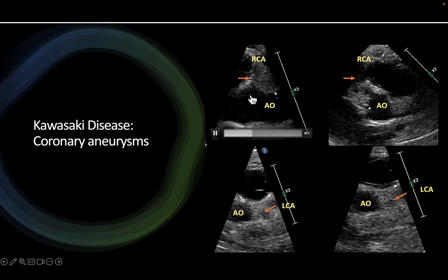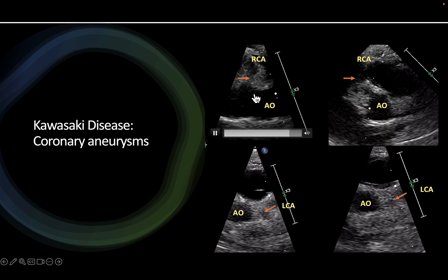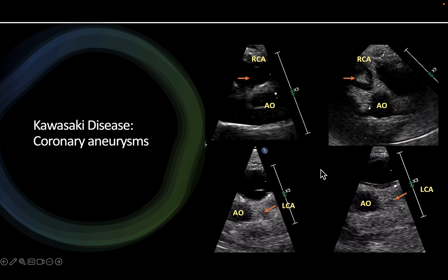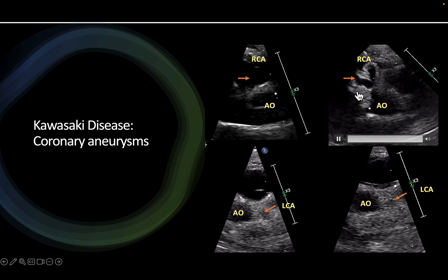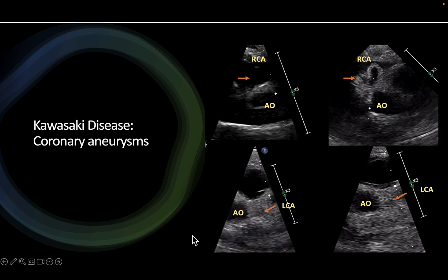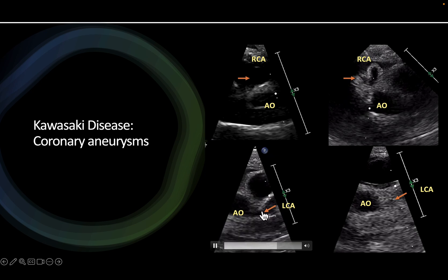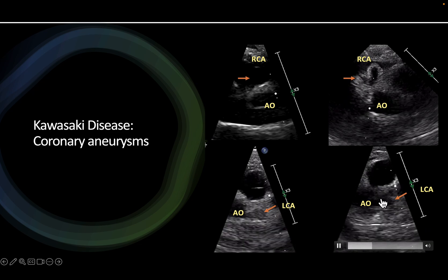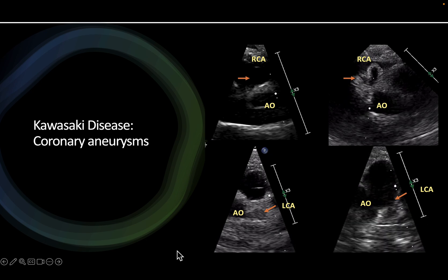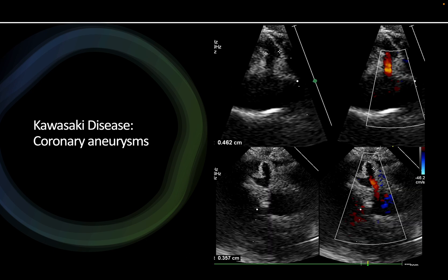In Kawasaki disease, I show you one patient where there is dilatation of the right coronary artery. You can see the right coronary artery arising from the aorta at the right sinus of Valsalva, with marked dilatation. The left circulation is also markedly dilated — the left main, the LAD, and the circumflex are all dilated. So there is dilatation of all proximal segments of the coronary artery in this patient. You take the measurement and then use a Z-score or pragmatic score to assess whether there is coronary artery dilatation.